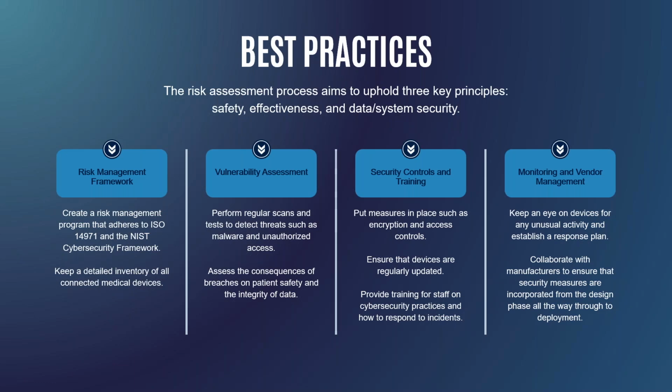And then security controls and training, implementing measures like encryption and access controls, keeping your devices updated, training staff on cybersecurity practices and incident response, and then monitoring and maintaining vendor management. So monitor those devices for any suspicious activities, have a response plan, and work with the manufacturers to make sure you have your external connections and remote accesses really dialed down and secure.